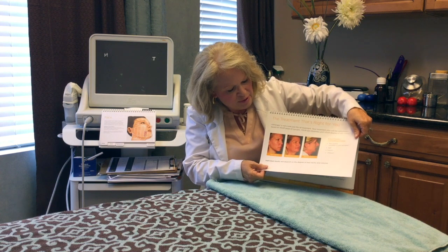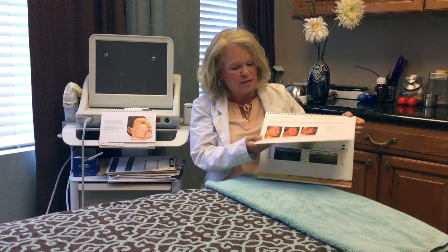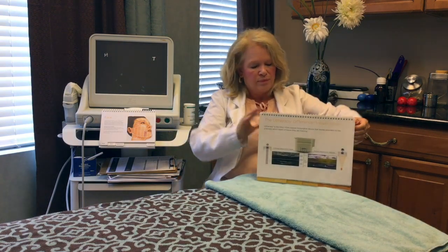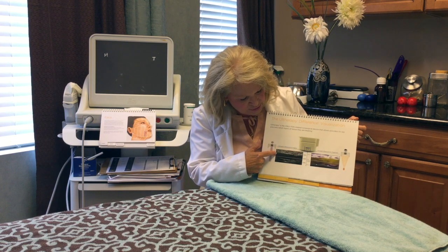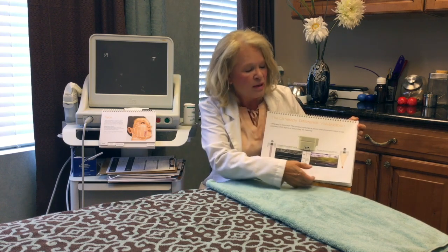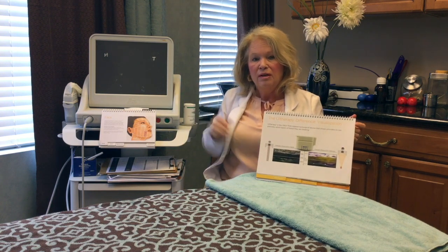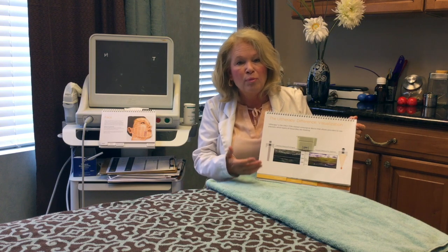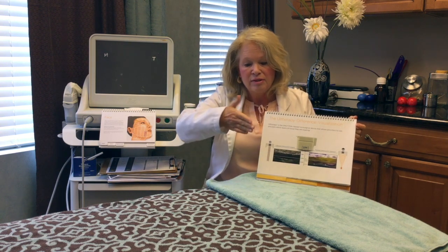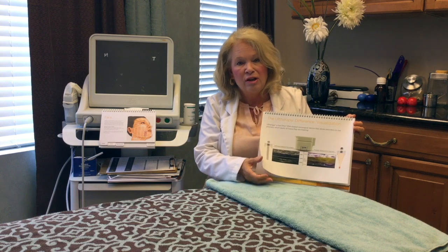This, by the way, is somebody after their first set of treatments on the neck and after the second, a tremendous change we can see over time. And here we can see what we actually see with the Ultherapy, where one can delineate where the dermis is, the subcutaneous layer and the SMAS level. Again, this depends on the person behind the transducer, the person using the machine, being able to properly identify the tissue that needs to be targeted, making sure there's proper contact with it, and that the transducer is properly at 90 degrees to exactly where you want it to treat, so that you get optimal results.